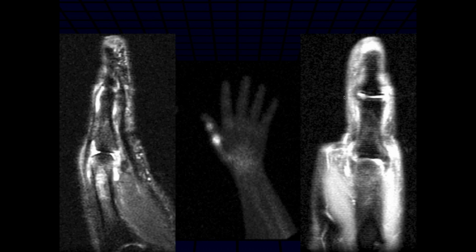interphalangeal joint as well as the metacarpophalangeal joint, and there's effusion extending both along the dorsal and volar aspects of that joint, and maybe some increased edema and maybe thickening. Actually, it looks almost mildly expansile of that distal first metacarpal. And so this patient had pain in this region and had surgery more proximal.